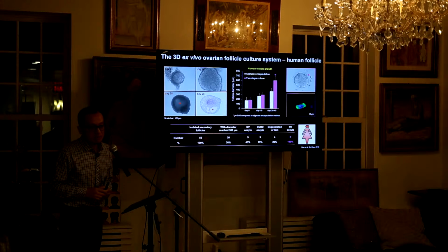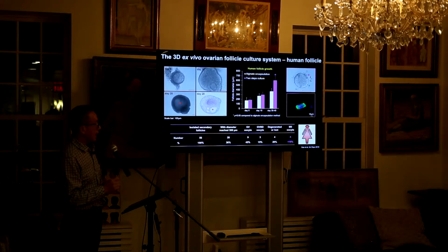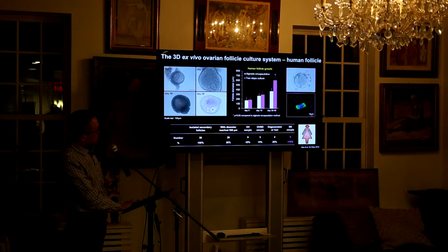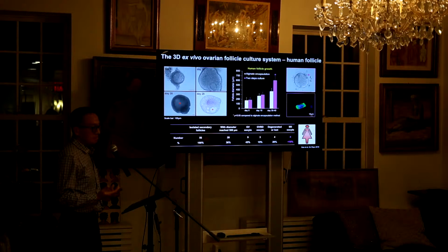Whenever a young female cancer patient wants to preserve their fertility, they will do the surgery and remove their ovary, and 20% of the ovary comes to me. I was the point of contact in Chicago to receive the ovary, and then I isolated about 56 secondary follicles and used the same method to culture them. It takes much longer, usually about 30 to 40 days, and the success rate is pretty low. We only got 4 M2 oocytes, but that's still the first M2 oocytes ever from cultured follicles. But the success rate is only 10%.